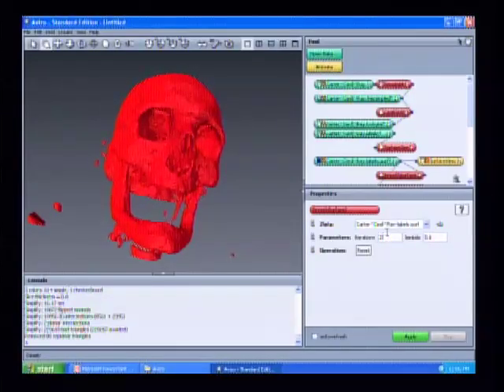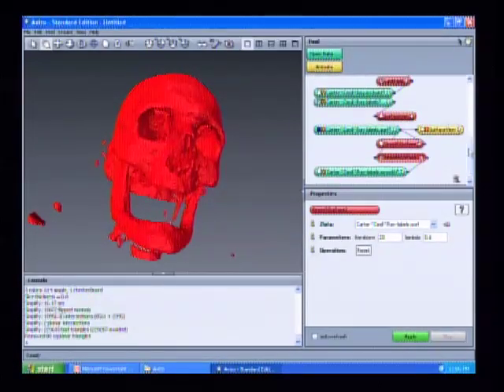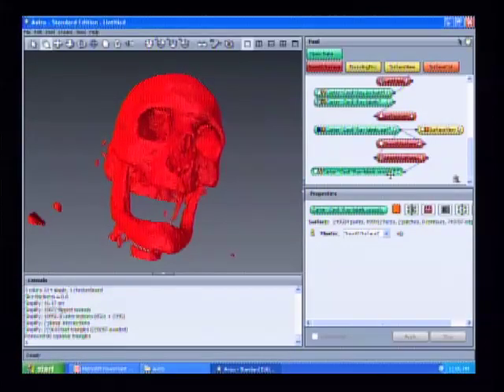Once you're there, you want to input 20 iterations, and just go ahead and click Apply at the bottom. I don't know if yours is the same, but we have so many files now that I need to scroll down, because a new file's been generated that has this smooth name at the end. What this one's done, we went from over 1 million faces to 500,000 faces, and we've smoothed it.